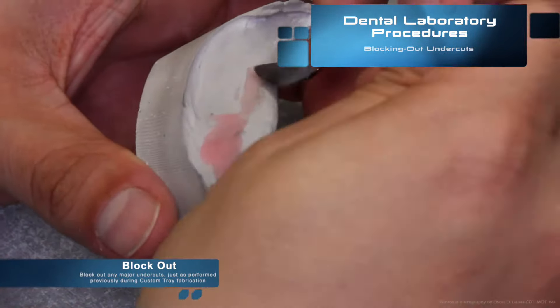Once blockout is complete, you can apply petroleum jelly directly to the cast. It will aid in the retrieval of the record base without fracturing any important anatomical landmarks.